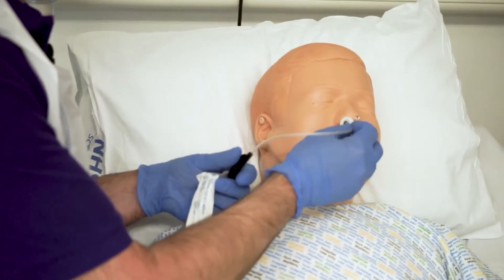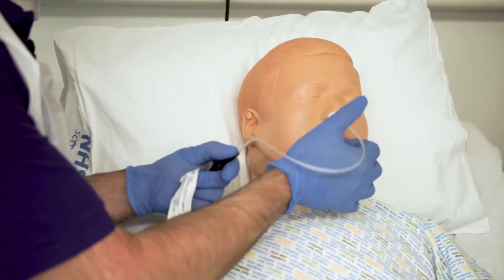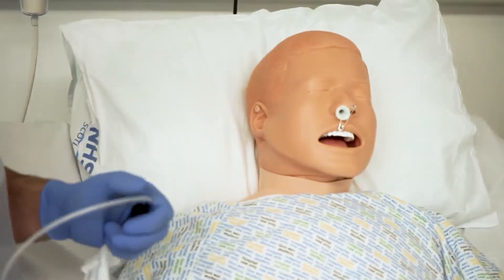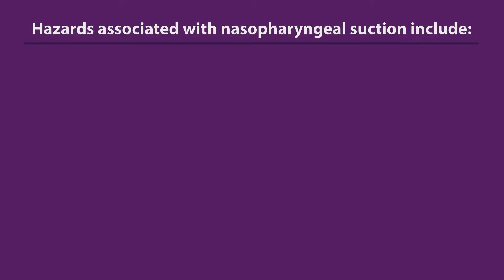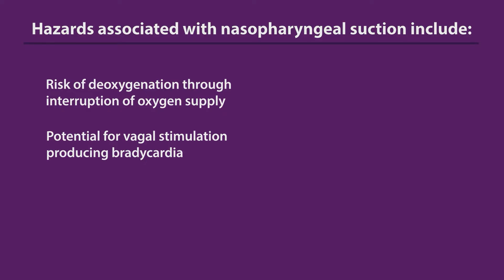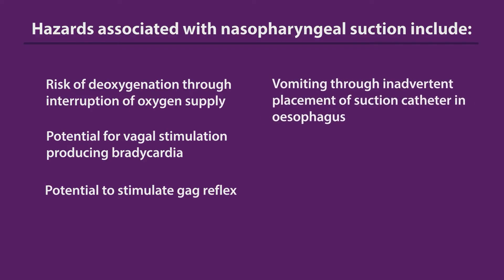There you go, Bob — you can cough that up for me. Applying the suction pressure only on the way out of the nostril. Hazards associated with nasopharyngeal suction include risk of deoxygenation through interruption of oxygen supply, the potential for vagal stimulation producing bradycardia, potential to stimulate a gag reflex, vomiting through inadvertent placement of the suction catheter into the esophagus, and trauma and bleeding.